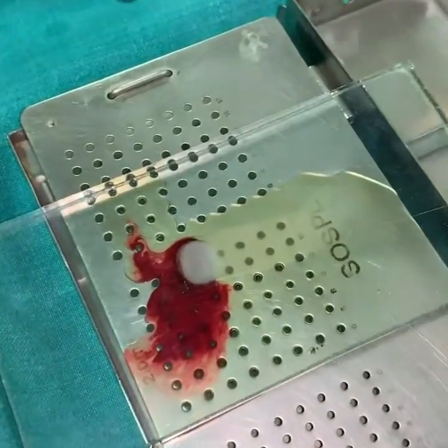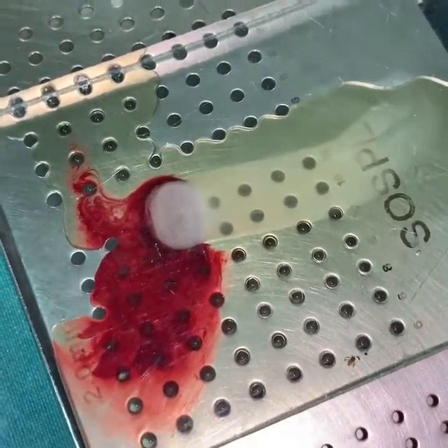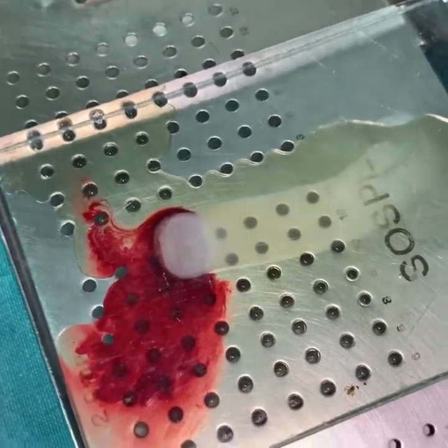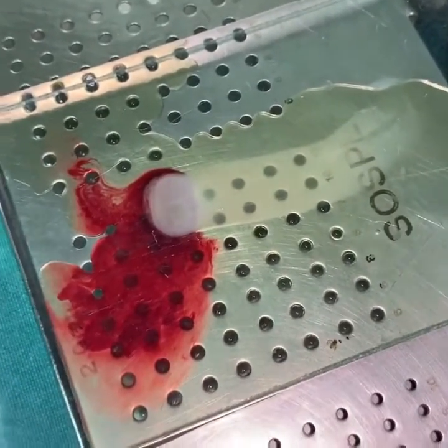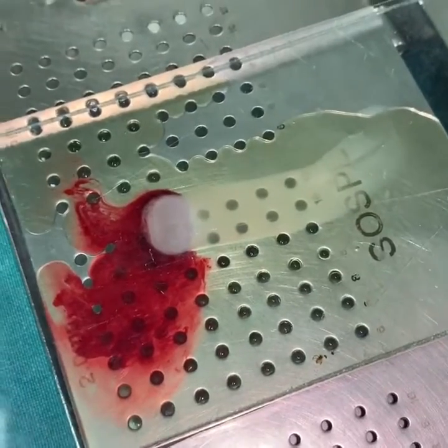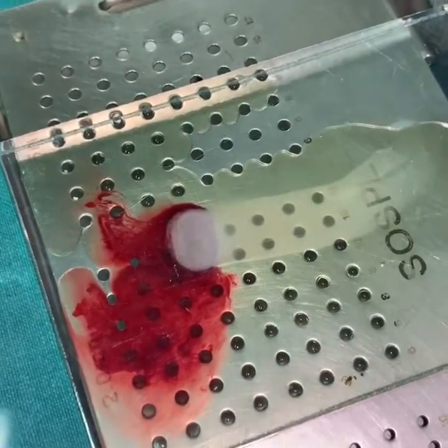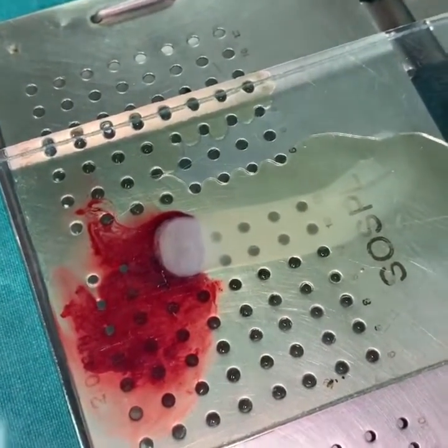Between the slides — see that — the longest one is probably about two and a half centimeters long, a nice membrane. This membrane can be used for various purposes in maxillofacial surgery. For this patient, we're doing a bone grafting and we're going to use this membrane to cover some of the areas of the posterior aspect of the defect. Then the bone would come over and we would wrap this membrane again on top of the bone.